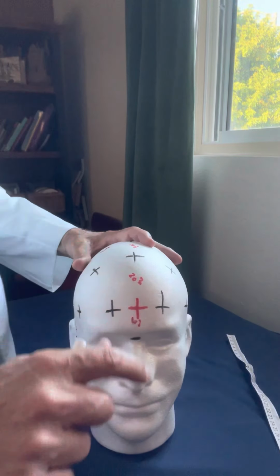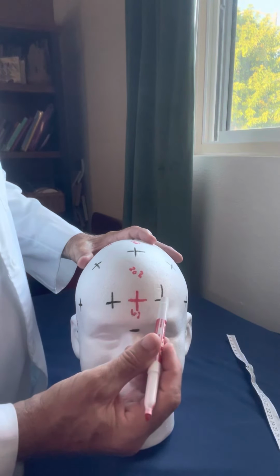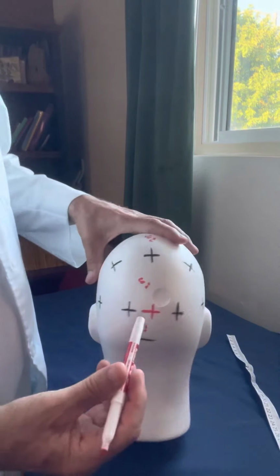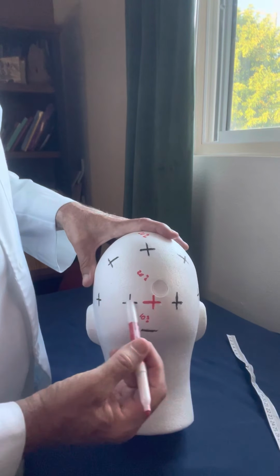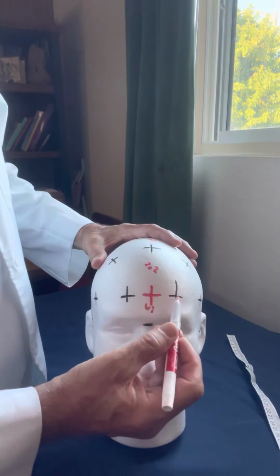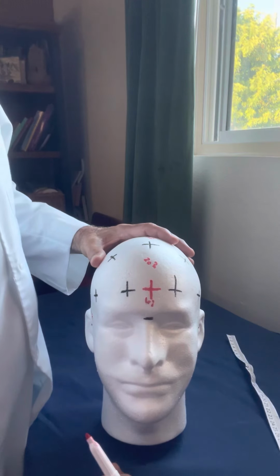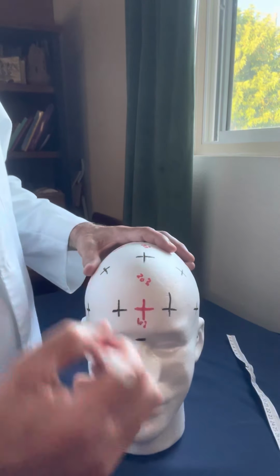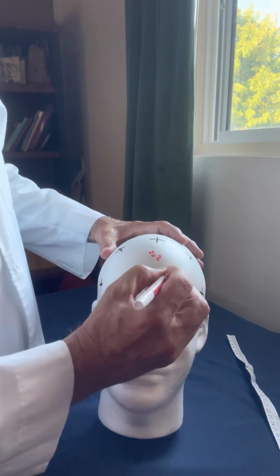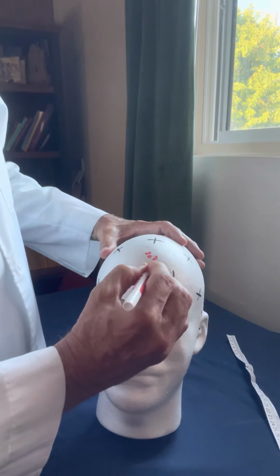Okay, now we're going to measure the distance between each electrode in the frontopolar transverse plane and the occipital transverse plane. The distance between FP1 and FP2 should be 10% of the head circumference distance.